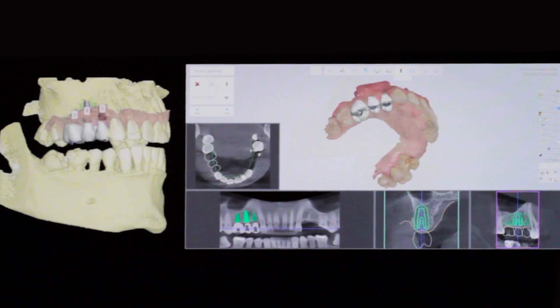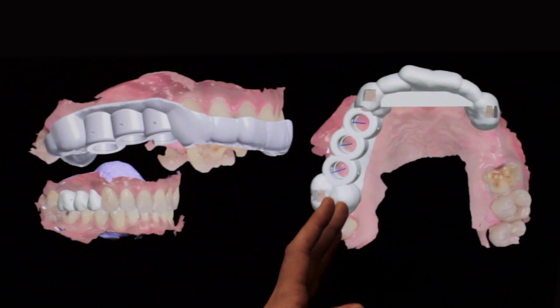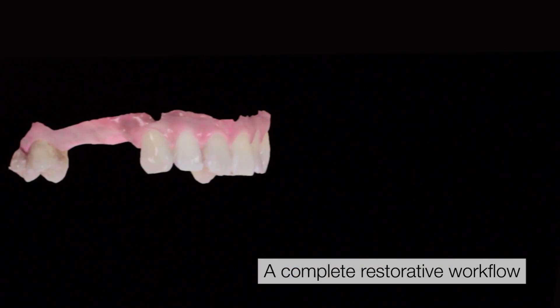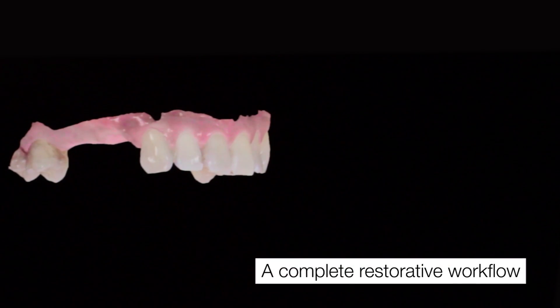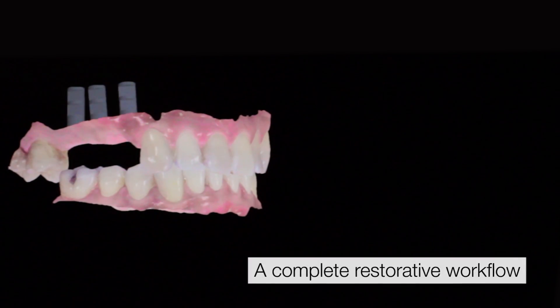A big advantage with the 3Shape Implant Studio workflow for us is the ability to take this information, create a surgical guide, and bring that information back into the dental design software before we actually do the surgery.